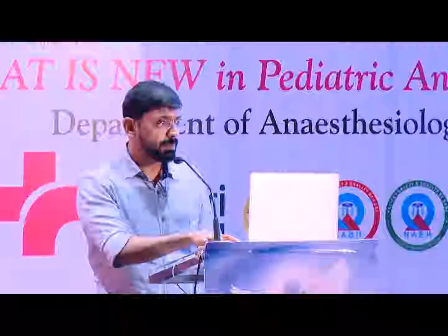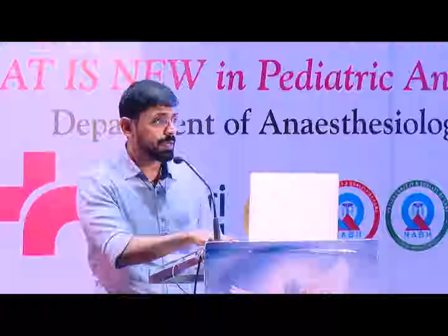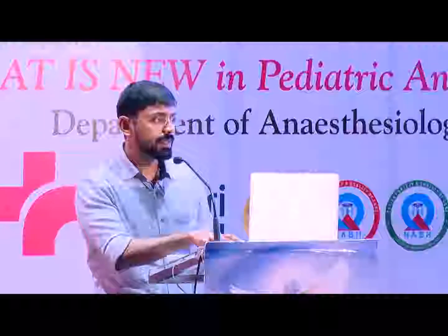Whatever preset number of breaths are given, they have a PIP and a PEEP, but the baby could very well breathe in extra, and whatever extra breaths the baby takes will be unsupported. On the other hand, very simply put, in assist control ventilation, whatever spontaneous breaths the baby takes will also be supported by the ventilator. Because that happens, the tidal volume delivered every time the baby breathes would be more friendly and more uniform.